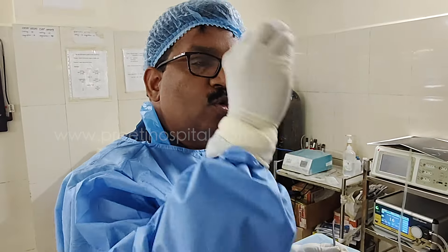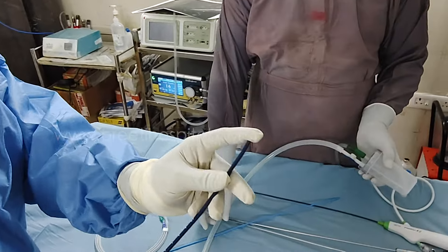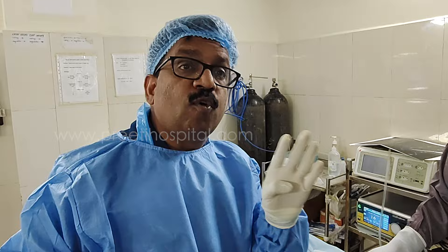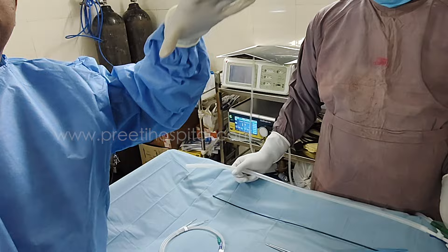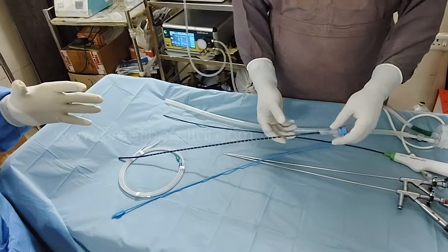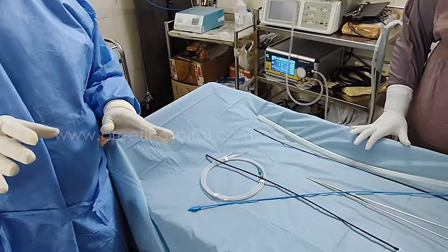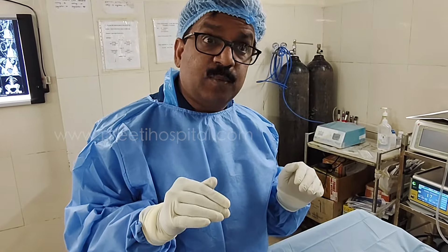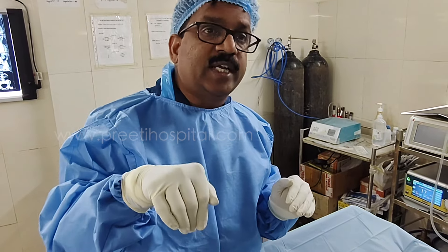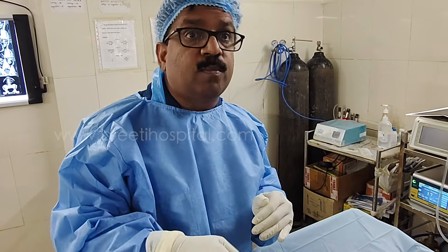There is a safety mechanism — it is a big vent. For example, if you put a lot of pressure, it will come out. Provided there is space between the sheath and the scope — a 4 French difference should be there, then water will naturally come out. If it is snugly fitting and you put too much water, disaster. This is the complete picture of the fan sheath. Now in this case, the plan is: remove the stent, pass the guide wire, pass the access sheath, go inside, see the stone size, accessibility of the flexible scope to the lower calyx, movement of the stones, impaction of the stone, and ability to see the lowermost border of the stone.